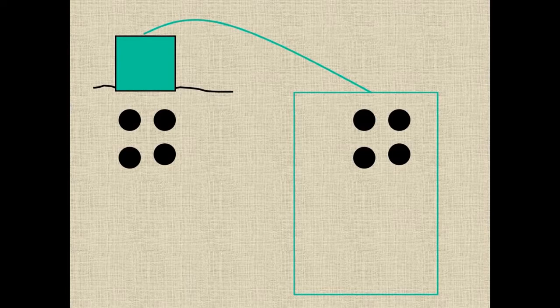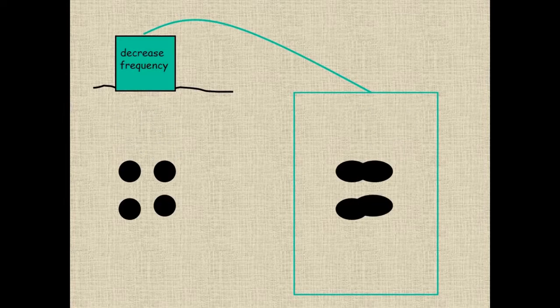So in summary, if we have 4 anatomical structures that are very superficial, it's likely the ultrasound machine will see all 4 entities as being separate, as shown in this picture. If we now move the structures to a deeper depth and have to use a reduced frequency, the first thing that would change will be the horizontal resolution.